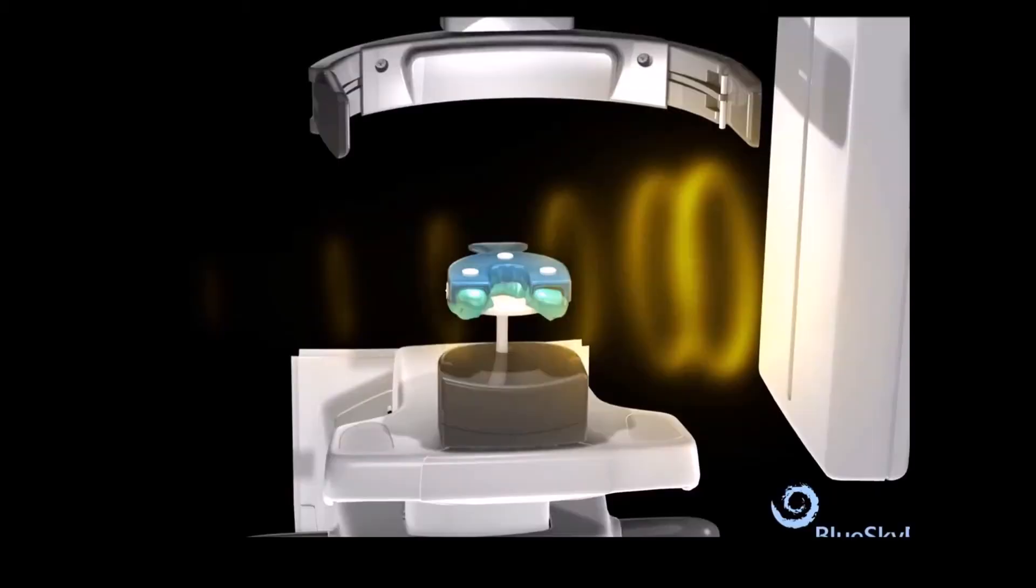Remove the impression tray from the patient's mouth. CT scan the impression with impression settings.